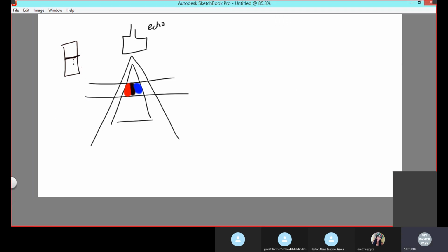Because remember, you always have to look at the color box. And they give you the colors like this. So red is supposed to be towards you and blue is supposed to be away from you according to the color box. To predict the flow, I made up this little rule: move towards away.